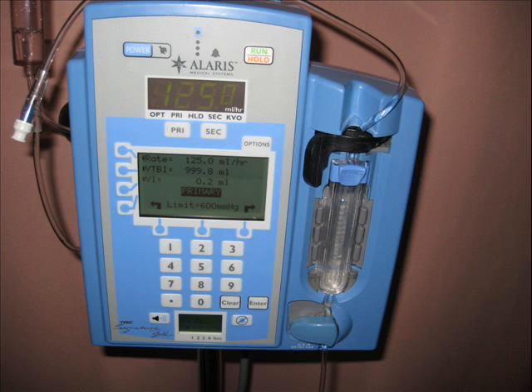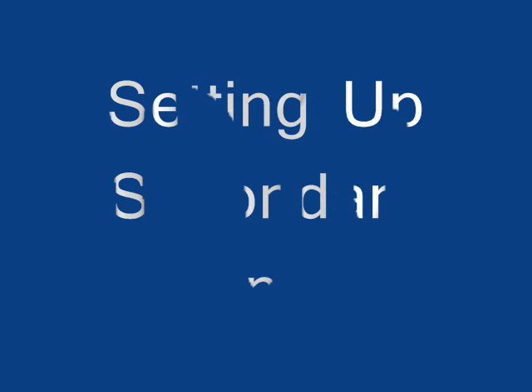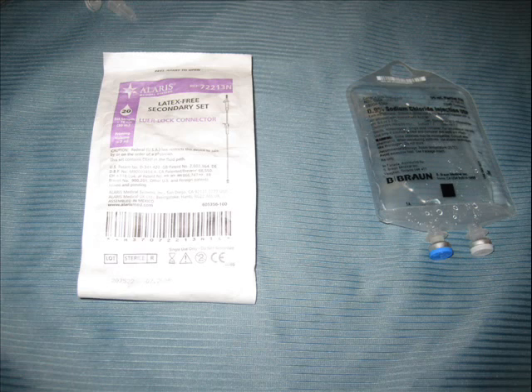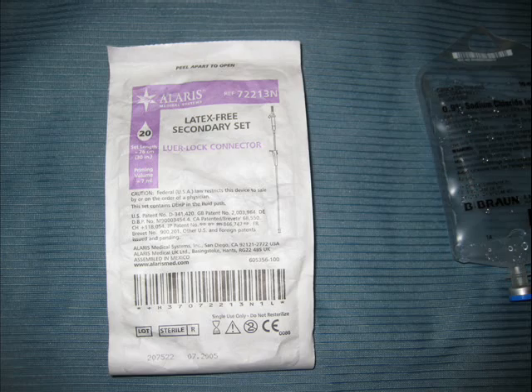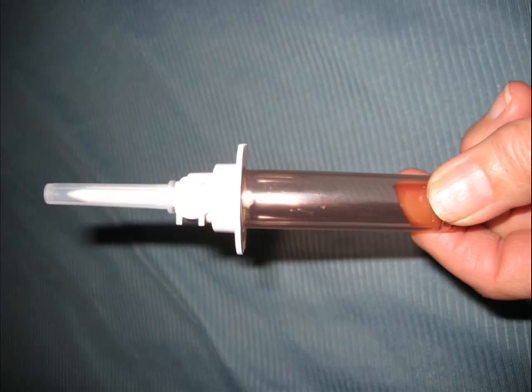We put the cassette inside the pump very gently — we don't need to hurry or push it in hard, it's a very gentle and nice process. Now our latch is closed and our pump is ready for infusion. To set up the secondary line, we follow almost the same rules as for the primary. We need to have our equipment ready — our line and our medication that we will administer.